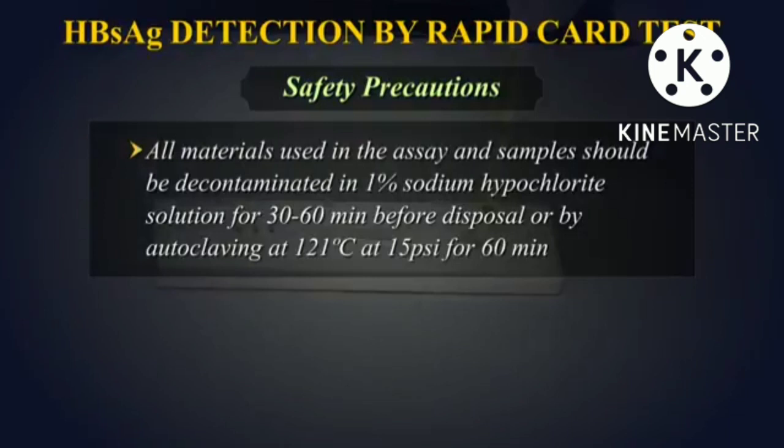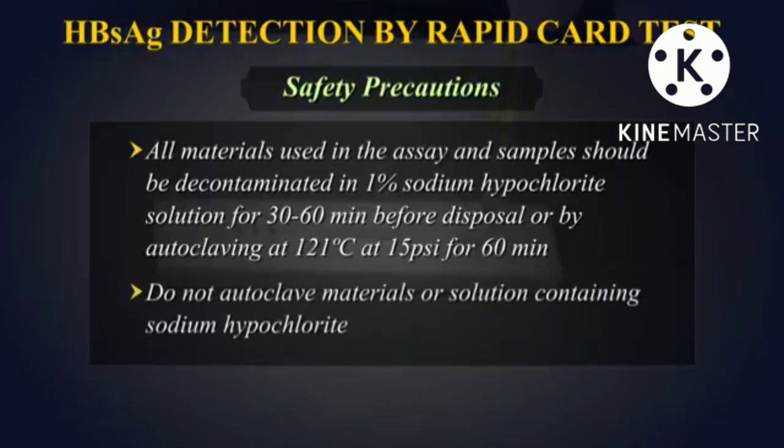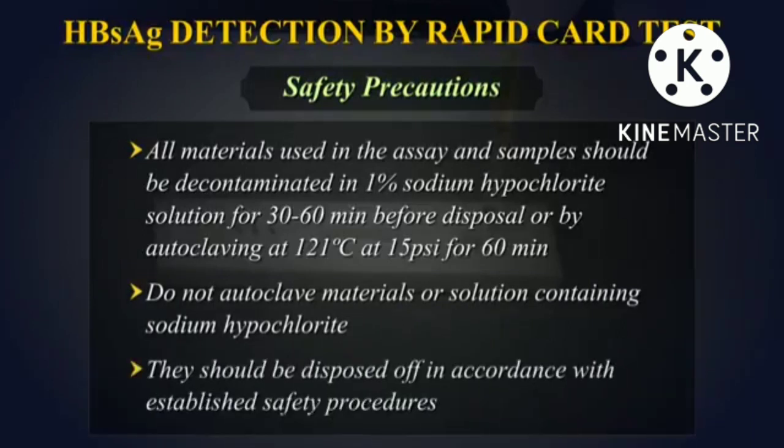All materials used in the assay and samples should be decontaminated in 1% sodium hypochlorite solution for 30 to 60 minutes before disposal, or by autoclaving at 121 degrees centigrade at 15 psi for 60 minutes. Do not autoclave materials or solution containing sodium hypochlorite. They should be disposed of in accordance with established safety procedures.